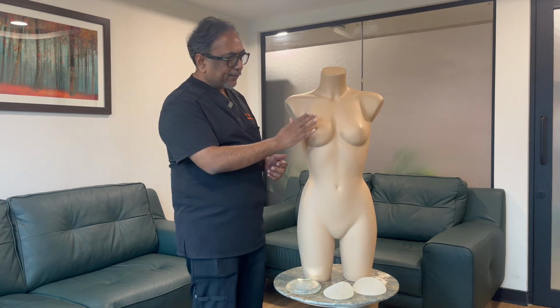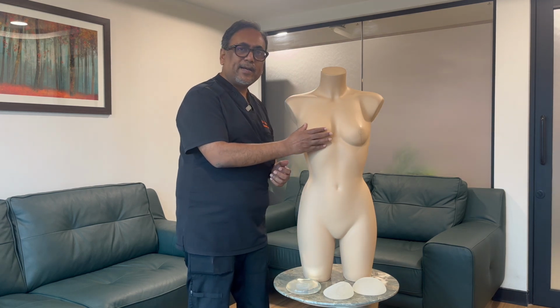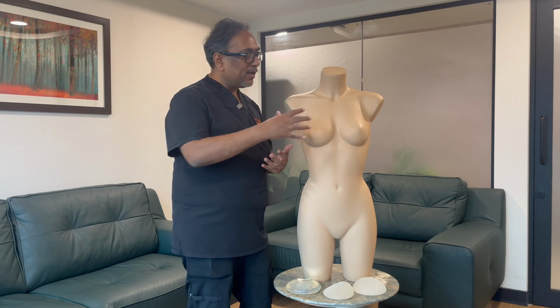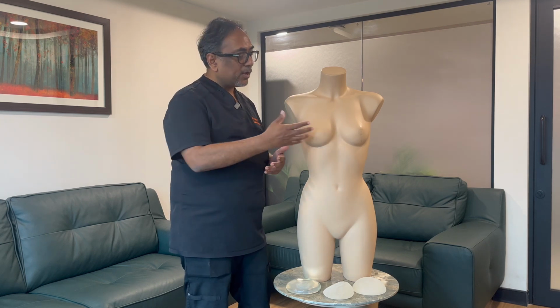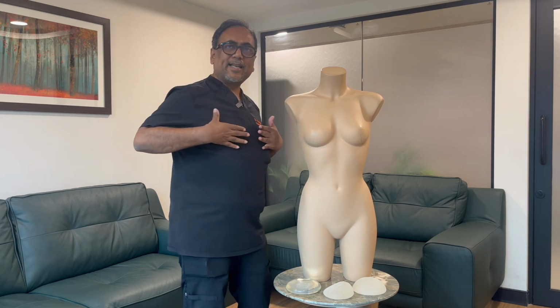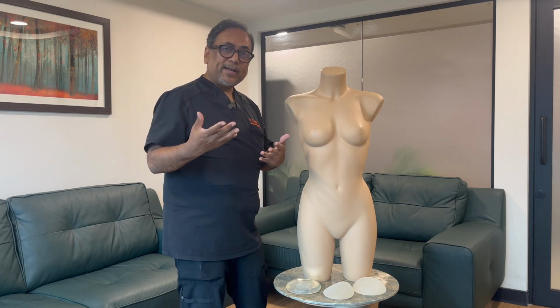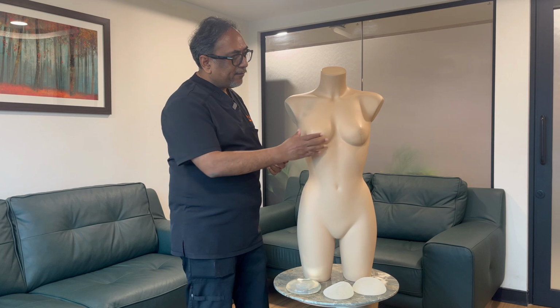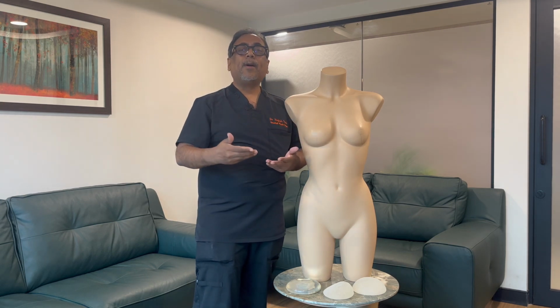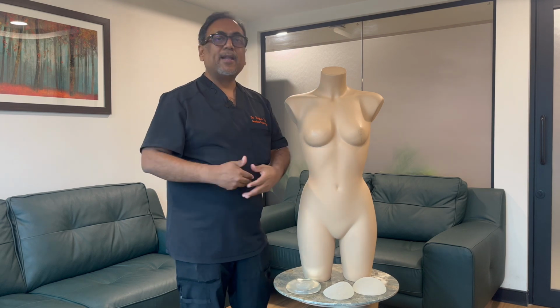Not only the base width, we also see how much the skin stretchability is, because very tight chested patients may not permit us plastic surgeons to put very big implants. So that's not a possibility in patients who have very tight skin on the chest. On the contrary, you might also find patients who have very loose skin. Whenever the patient has loose skin, it might permit us surgeons to use a bigger implant.